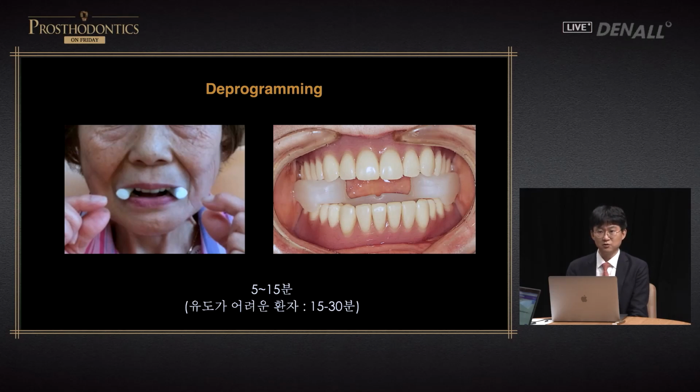If you try this, you will find it very effective. I believe you learned in the past that deprogramming can make a condyle very comfortable and inducing it very easy, but if you really do it, you will feel the big difference. Biting on cotton rolls helps, and on the right hand side you see the product that I bought. If you chew on it, it helps to deprogram the muscles.